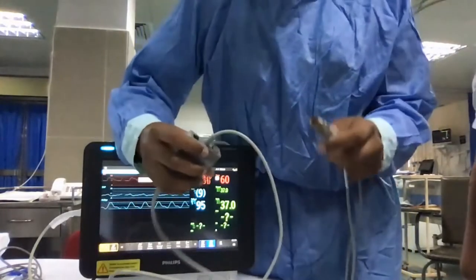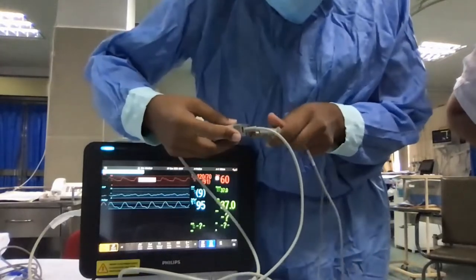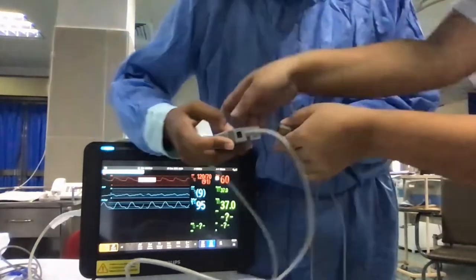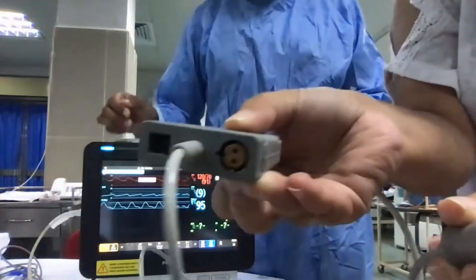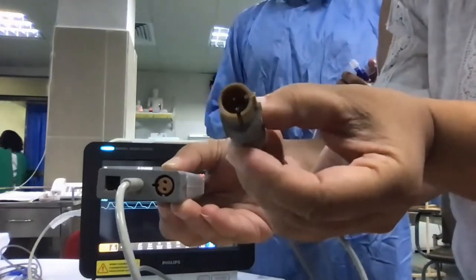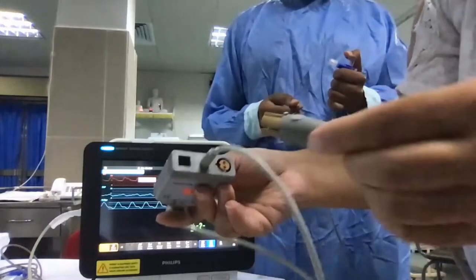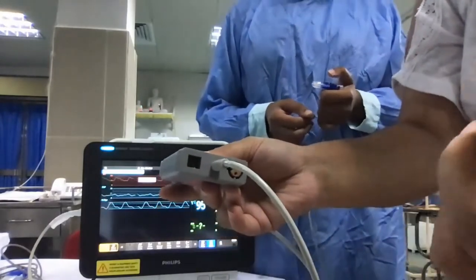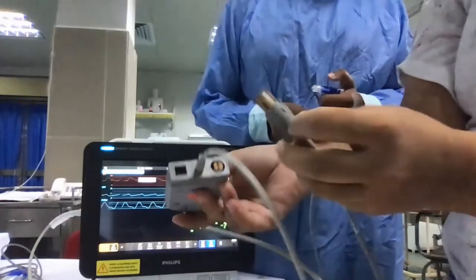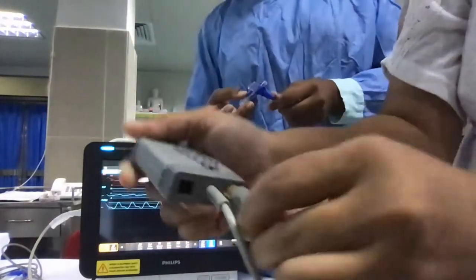So this brown color port goes into the brown color port of the cardiac output cable. So you can easily connect it like this. So this is the end. Look carefully. It has two pins inside. Can everyone see? Is it clear? Yes, two pins. It has two pins and it has two receiving holes. Can you see on this side? It is brown, so as I said, it is color coded. And you can see there's a gutter and a ridge here. So it nicely fits into the gutter and the ridge. So carefully you have to fix it without damaging the monitor. That's how it is. All right, so it nicely fits in.